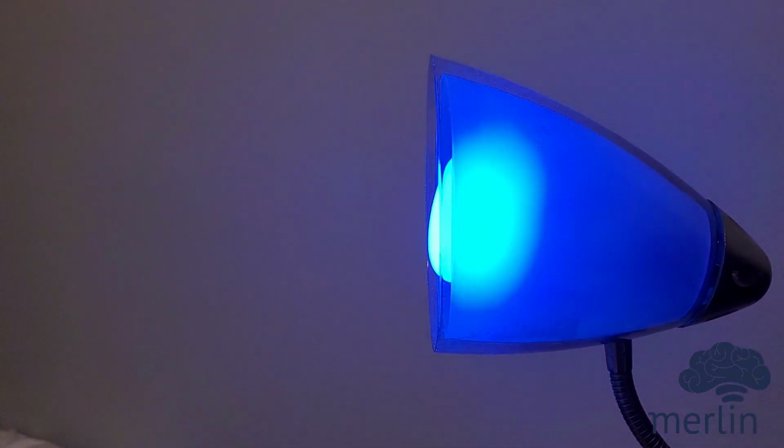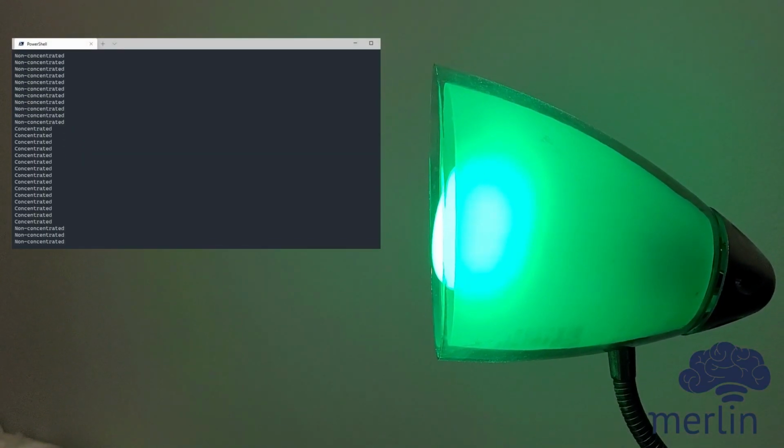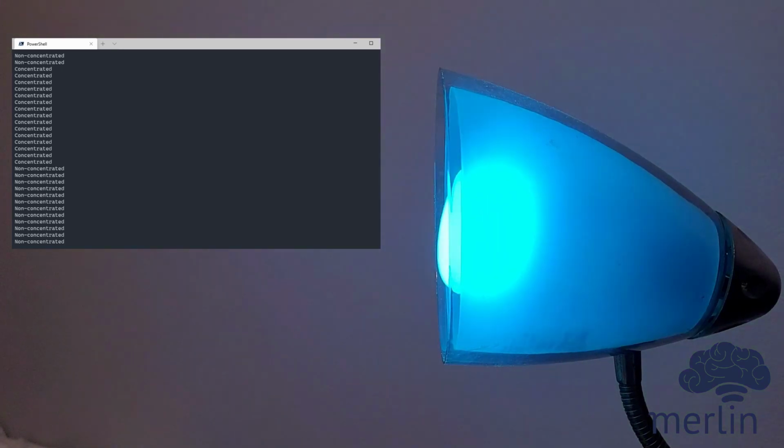The modular approach to development encouraged better creativity and freedom when programming the function in the BCI's action component. We used the Philips Hue Smart Lightbulbs API to connect to a smart light bulb over the internet. Then, depending on the classification output from the BCI's classifier component, which we use to determine relaxation or concentration, the light color changes from a vibrant green to a deeper blue.